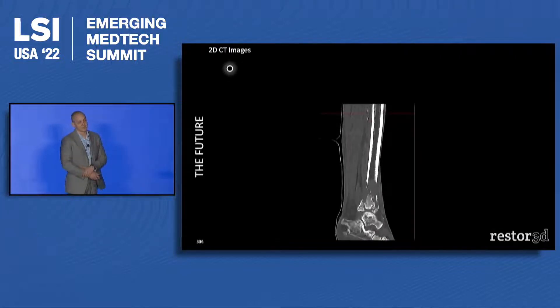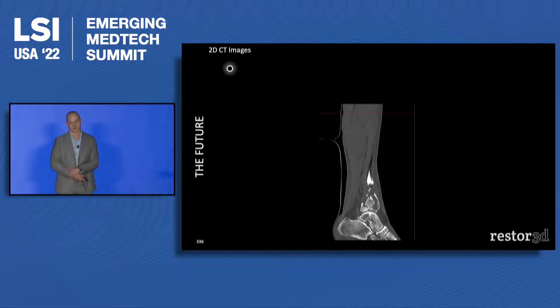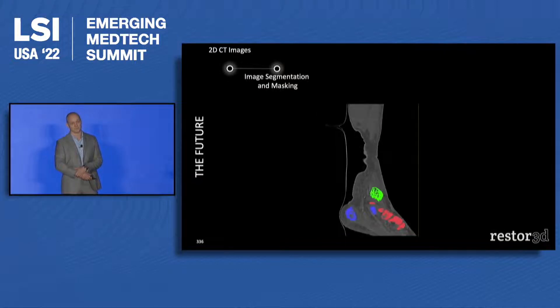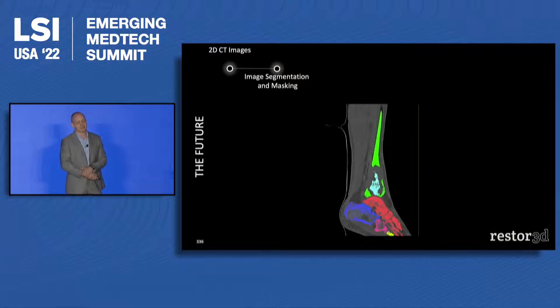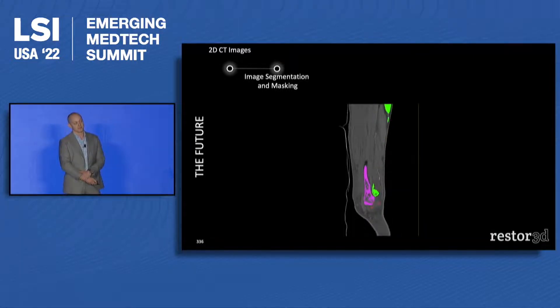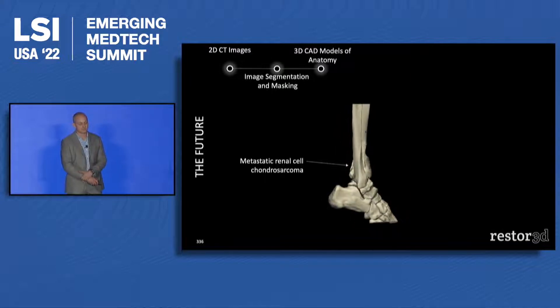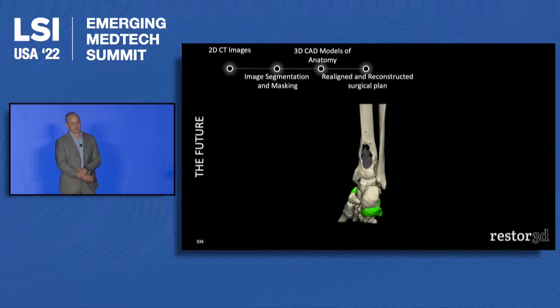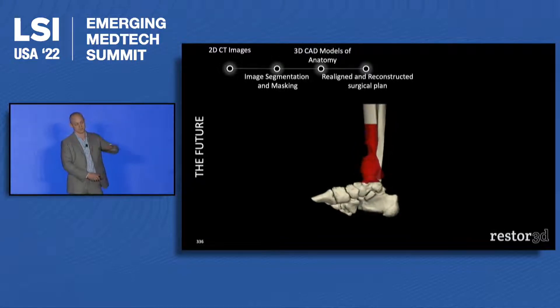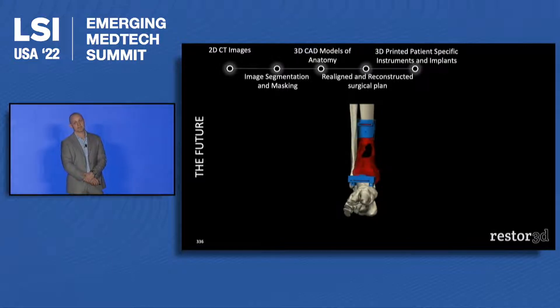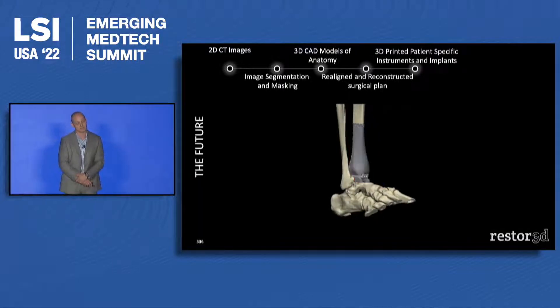This is an example of a very complex surgery — an osteosarcoma or chondrosarcoma of the foot. You start with a CT image of the foot. We then come in and mask and segment that, breaking down all the bones and figuring out where they're positioned. We convert that into a three-dimensional model of the anatomy, identify the chondrosarcoma, and then realign and reconstruct it to develop a surgical plan. In this case, that involves a resection of the bone. We plan and 3D print instruments specific to that patient and that resection.